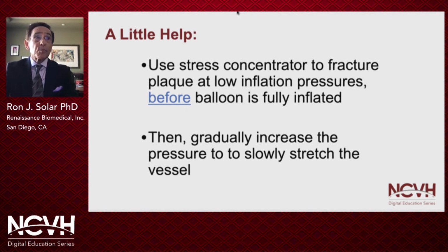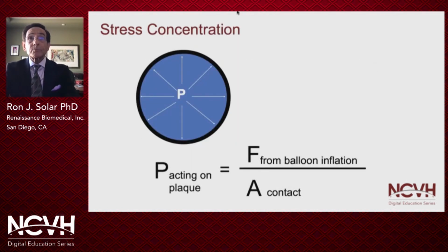And this approach would be to use a focal force or scoring balloon to provide the stress concentration. What's important, though, is to break the plaque before the balloon is fully inflated, and then slowly stretch the vessel wall.